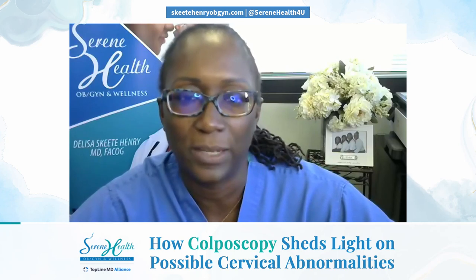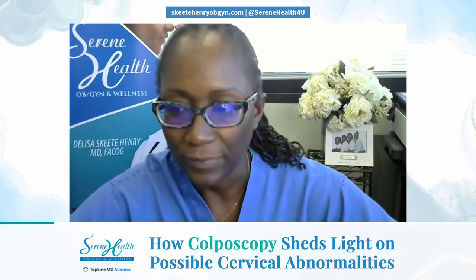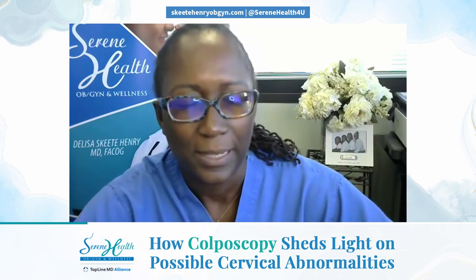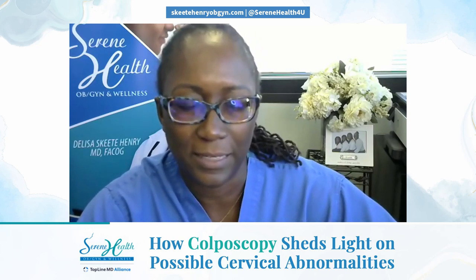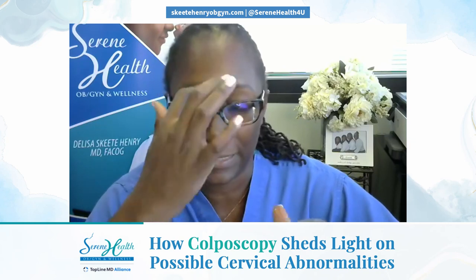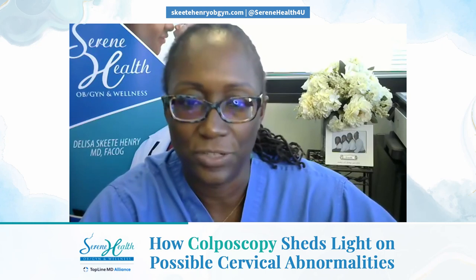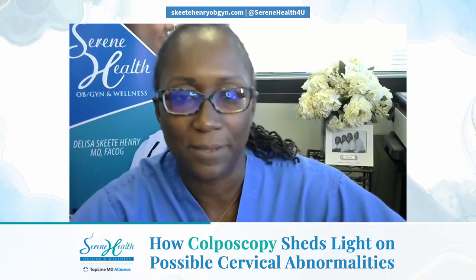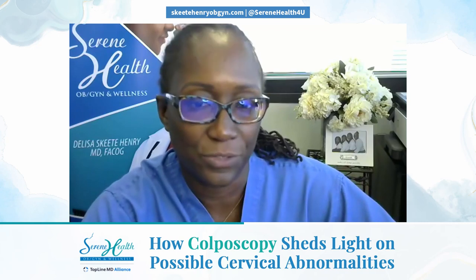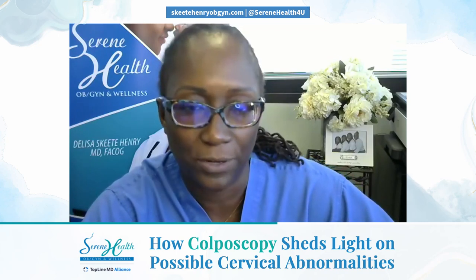The colposcopy is essentially looking at the cervix through a high-powered microscope. We put an acetic acid solution on the cervix, and it highlights any areas that may be abnormal. It sort of desiccates or dries the tissue. We look for what we call acetyl white changes — specific changes that may indicate that this area on the cervix is abnormal, and it may require a biopsy.